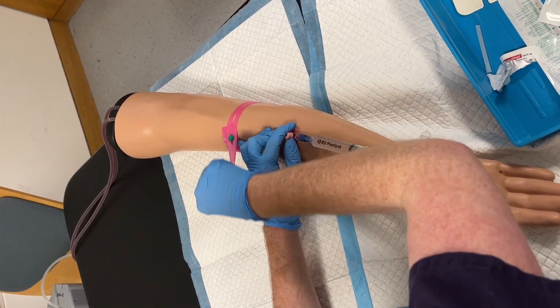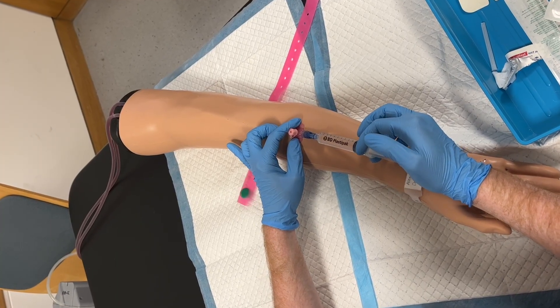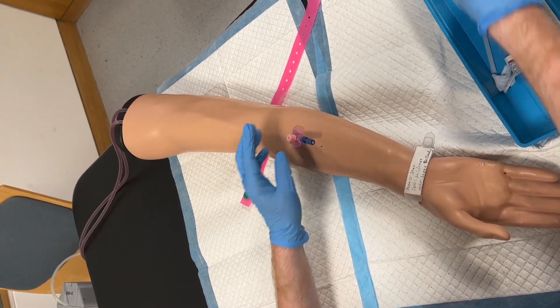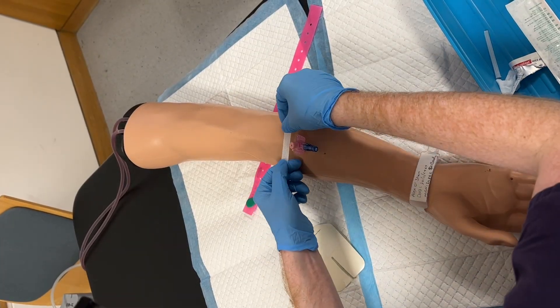If you require blood tests to be taken at the same time as the insertion of the cannula, and your hospital policy allows for this, the connector port can be placed on the cannula prior to the bung, and the blood tests can be taken. It is important that this is done before the cannula has been flushed with saline.